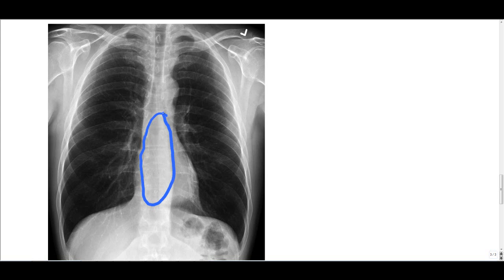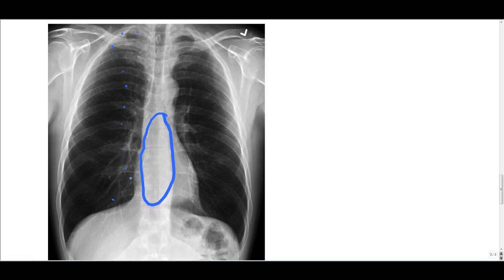Then next, we're going to look for inspiration. Can we see 8 to 10 ribs? Yeah, count our first, count our second, third, fourth, fifth, sixth, seventh, eighth, ninth, tenth, and almost 11th. So we got at least 10 ribs present. So it's a very good inspiration.